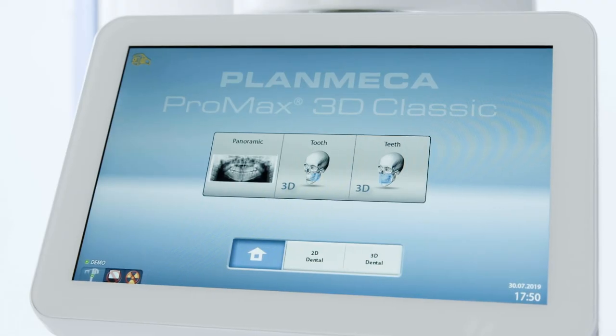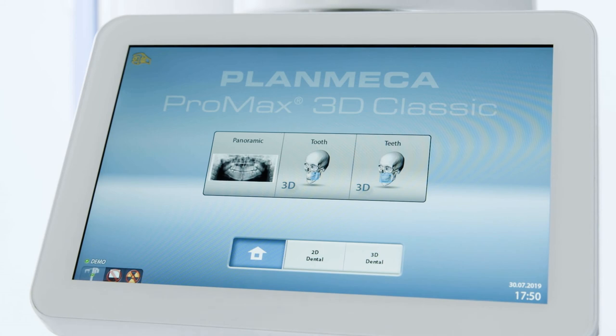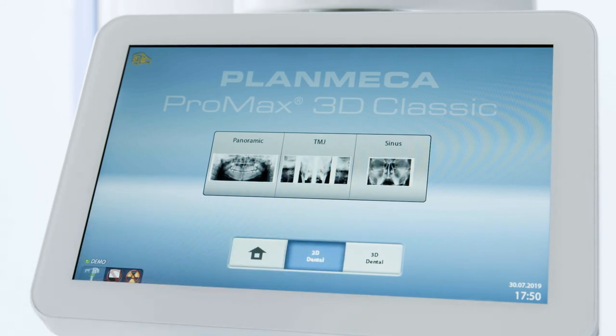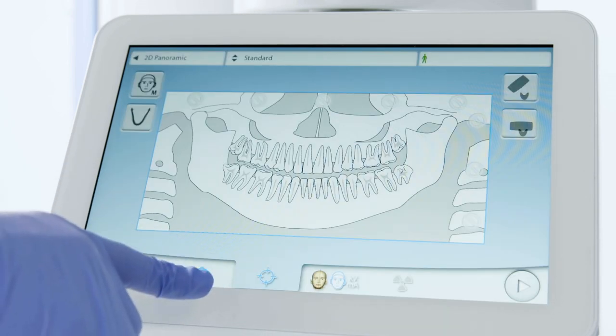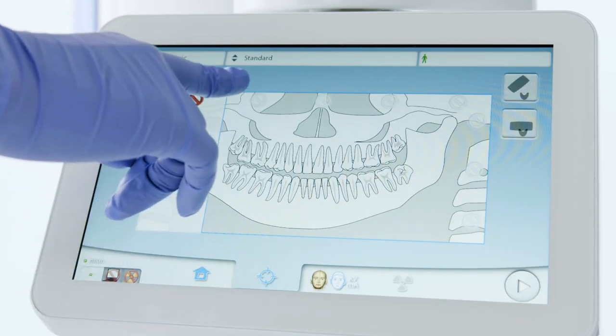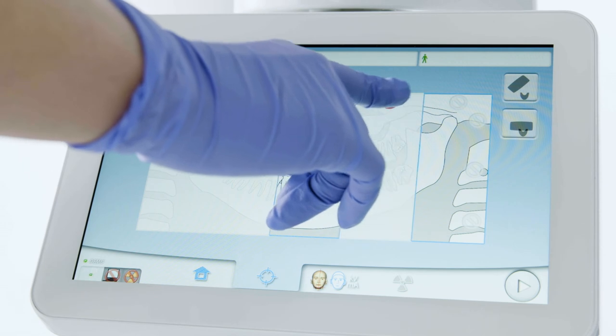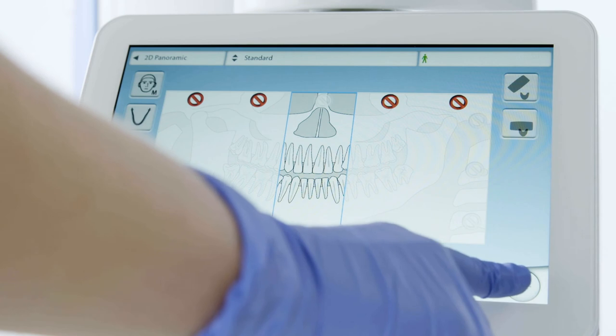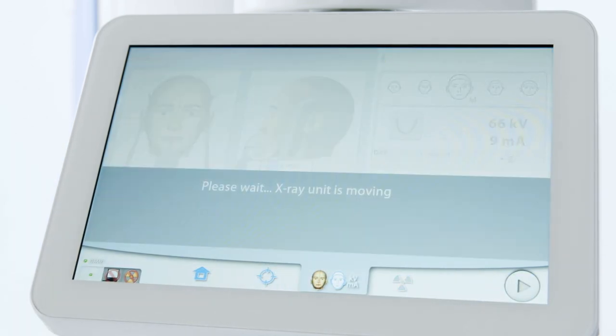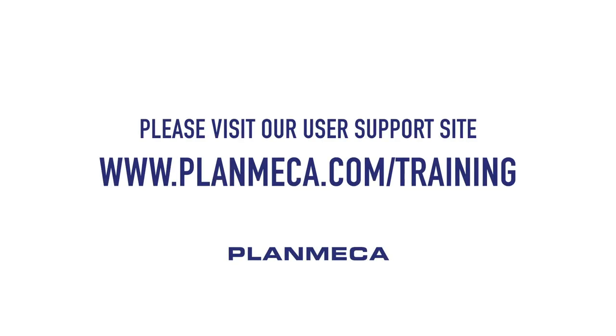For periapical setup to capture a segment PA-like view, select 2D Dental then Panoramic from the touchpad of your Pro Max X-ray unit. To isolate the desired region of interest, select the radiation symbols. Press Forward in the lower right of the touchpad to continue, and follow the rest of the 2D Panoramic with autofocus positioning instructions. For information on adding or selecting a patient, please visit our user support site at planmecausa.com.